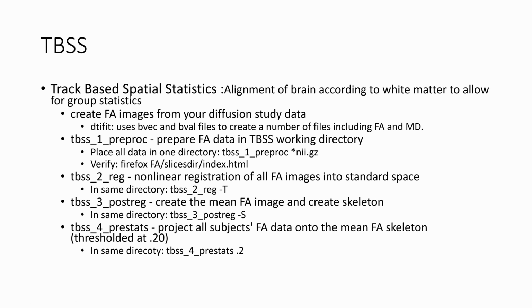And it's going to have the problem as well when you're working with the FA values. I think about it as the quality of a road. When you look in Google Maps and you see all these roads everywhere, you go, oh, there's lots of roads here, we're good. There's not so many roads here, that's not so good. But if you have lots of potholes, if you have sinkholes where large sections are gone, then those fibers going out aren't going to do you as much good. If you don't have a path connecting all the white fiber, that's going to be more of a concern about the person's brain.